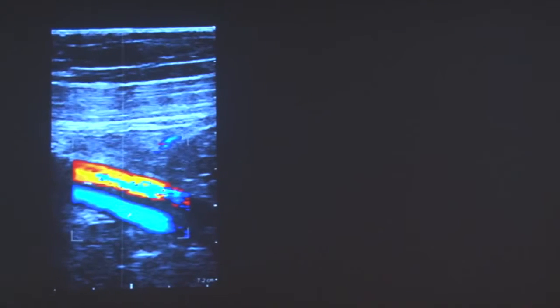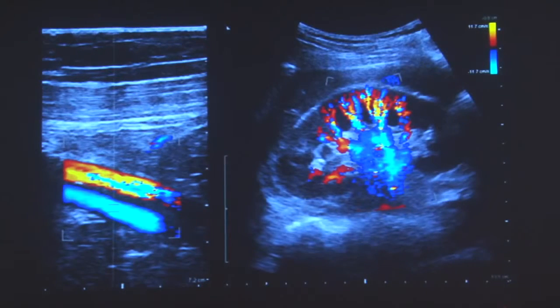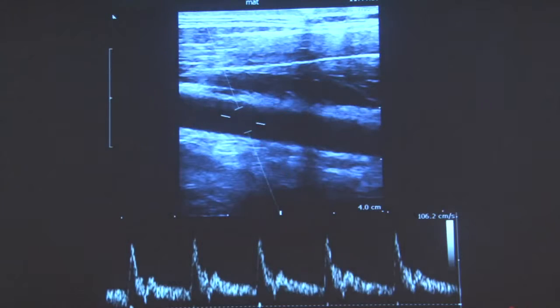Velocity estimation is important because it gives us a good view of the cardiovascular system and what's happening in the arteries in terms of flow, or perfusion in kidney or tumor. These images here are a traditional color flow imaging approach, and what we see is actually flow either towards or away from the transducer, which is here up at the top. If we want more quantitative data, the way doctors do today is that they use a spectral estimator.